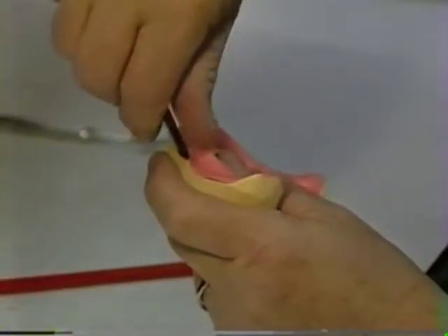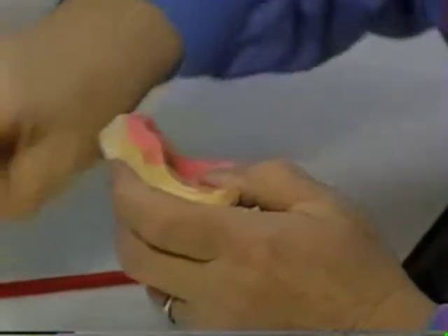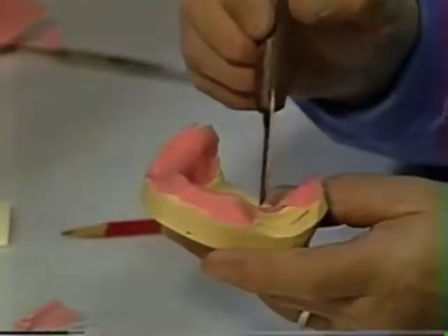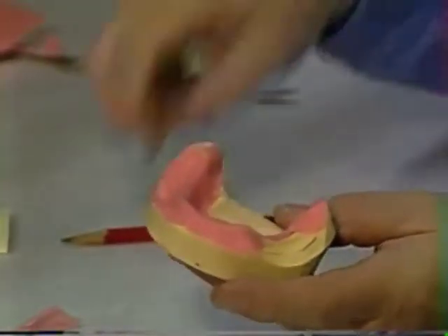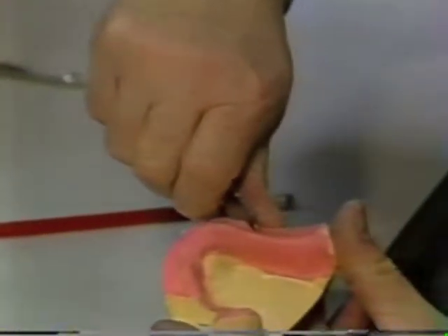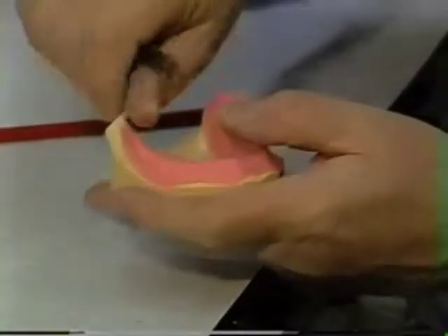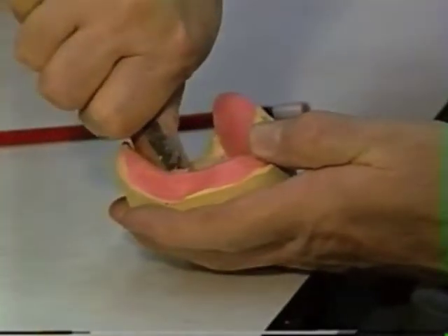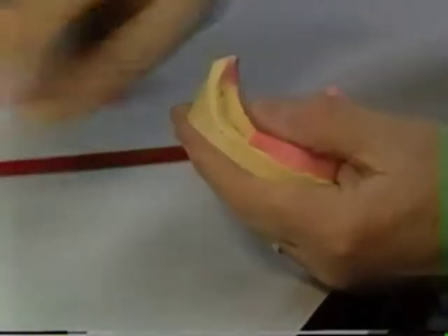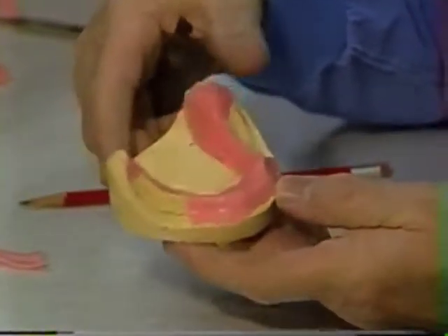And we can get rid of the wax off of that. Yes. Okay, now we've uncovered the entire buccal shelf area, and we can use that as a stop. Do the same on the other side. If you're going to do it, cut them as stops. Just cut it from the crest of the ridge out, all the way out, but make sure that you've got it wide enough and large enough to create a good stop rather than just a real tiny little area, as I'll see some of them.